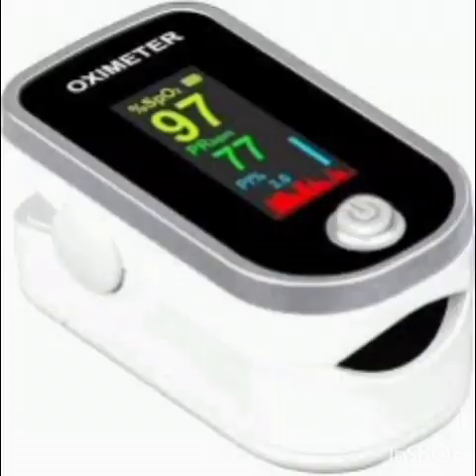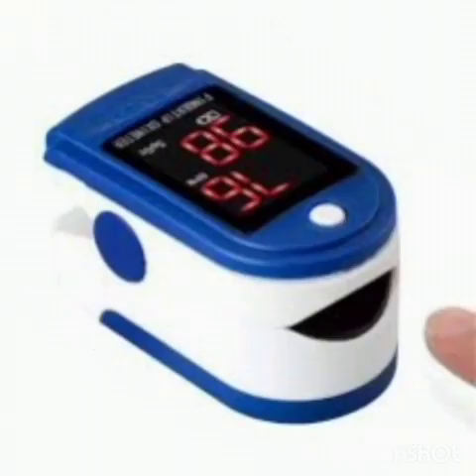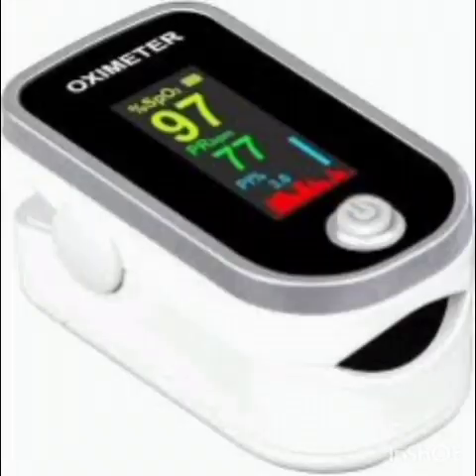The function of pulse oximetry: the normal range is from 95% to 100%. It is convenient, as the measurement can be continuous. It consists of a peripheral probe, a microprocessor unit display and red and IR light emitting detector.